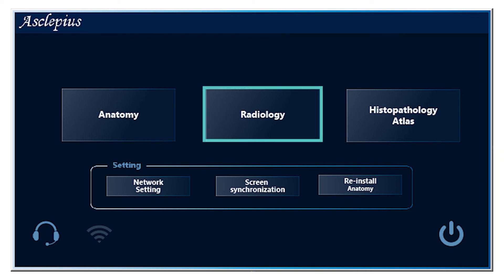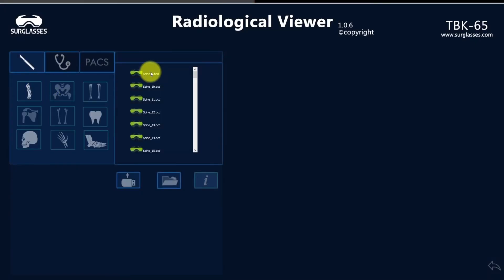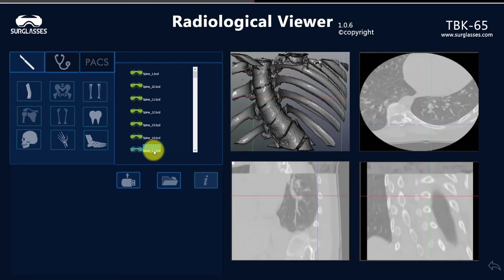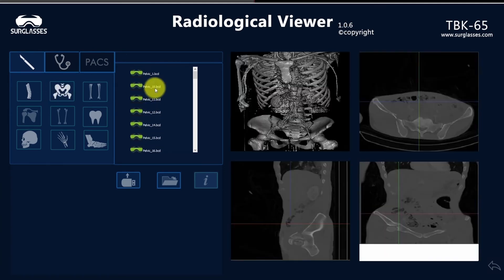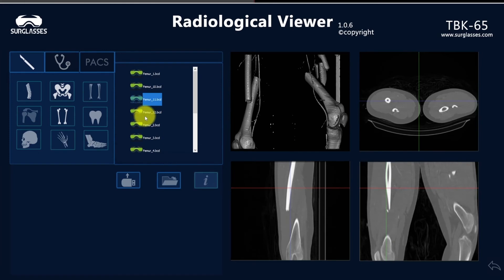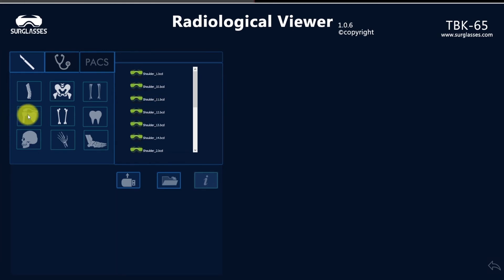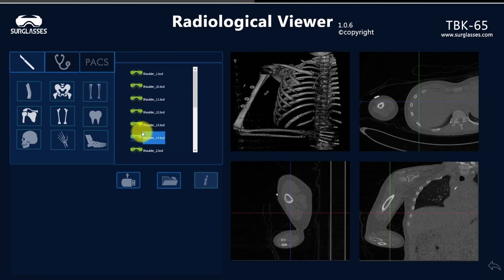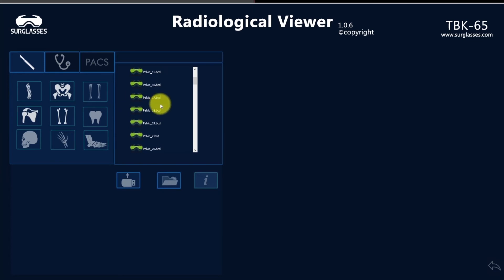Another software package is the radiology module, which works as a radiological station and includes more than 200 case examples of real-time patients collected from many different hospitals.